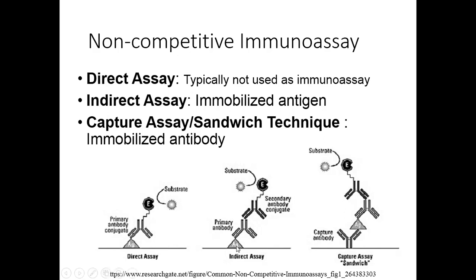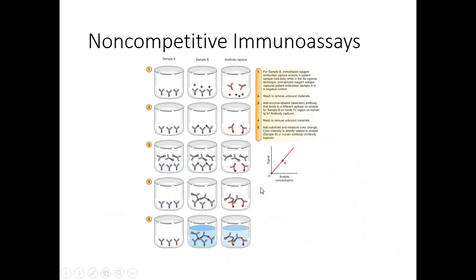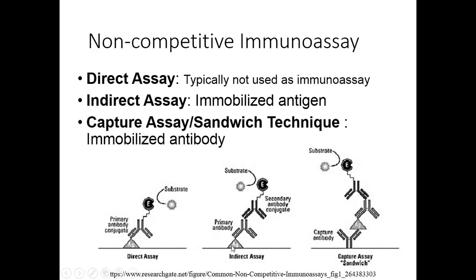So in this case, they have immobilized antigen to the solid surface, and then we add the patient sample. That's the primary antibody that's from the patient. We wait the requisite amount of time for the binding to take place, and after that, we formed a complex, or we potentially formed a complex. So what did we do before we add anything else? Exactly, we washed. Then we made a second addition. We added a secondary antibody, another anti-human antiglobulin that's labeled enzymatically. So now we have a complex of an antigen, a patient antibody, and an enzyme-tagged antibody.